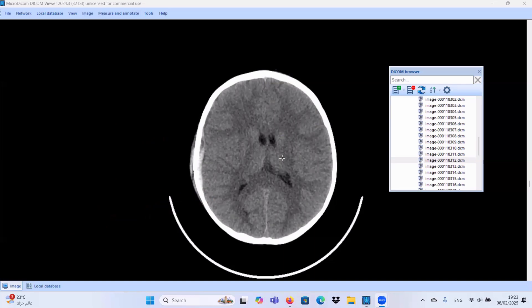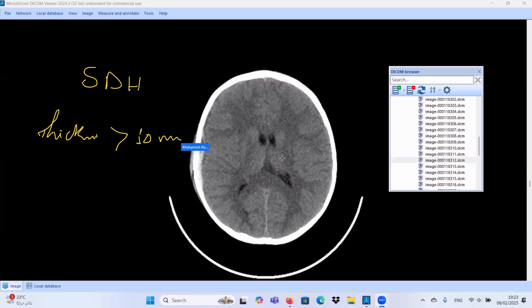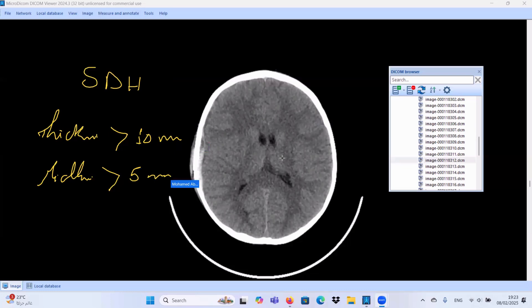We have a suggestion of active bleeding, so close follow-up is recommended. To summarize the indications for surgery in subdural hematoma: if the thickness is more than 10 millimeters, or if the midline shift is more than 5 millimeters, those are the indications for surgical interference. This case is not yet indicated for surgery, but we have the swirl sign, so close follow-up is very important.